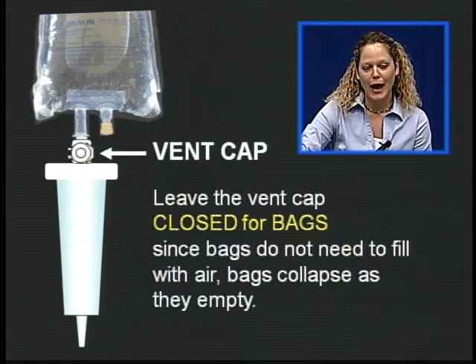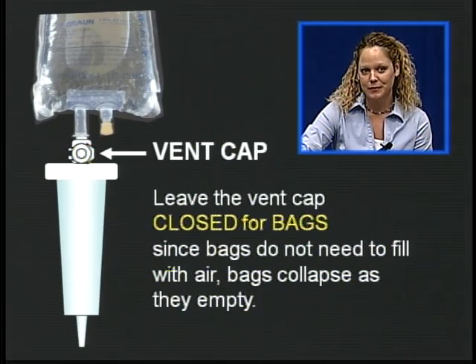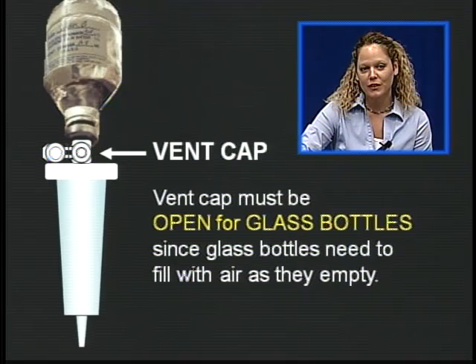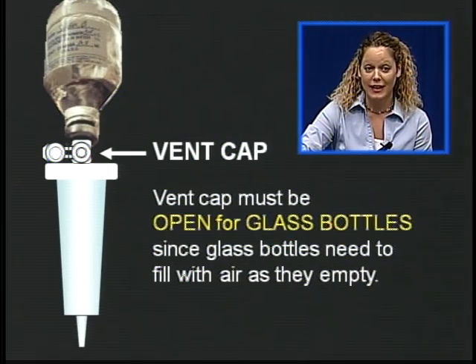Here's our vent cap. This sits on top of the drip chamber. We leave the vent cap closed for bags, since bags do not need to fill with air — bags collapse as they empty. However, the vent cap must be open for glass bottles, since glass bottles need to fill with air as they empty.